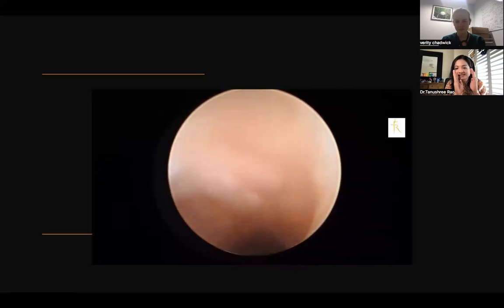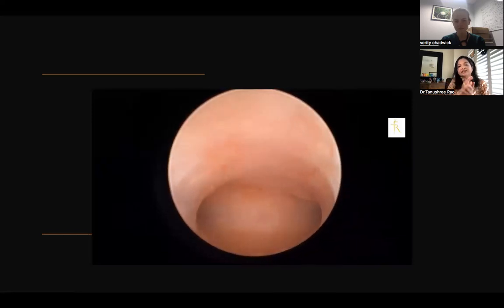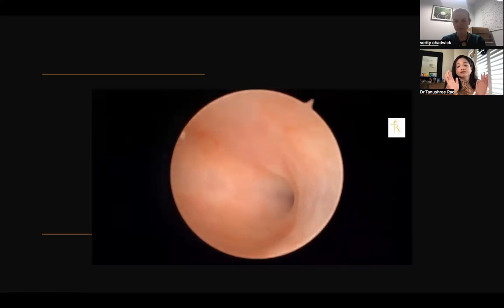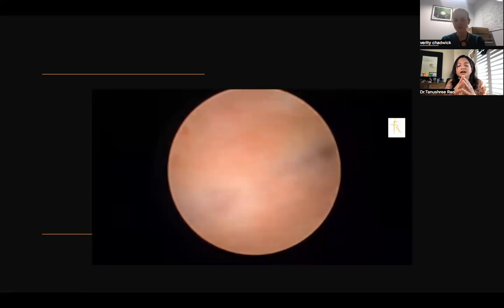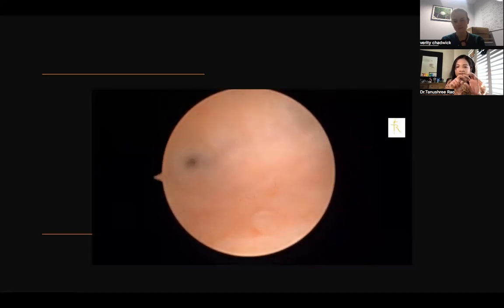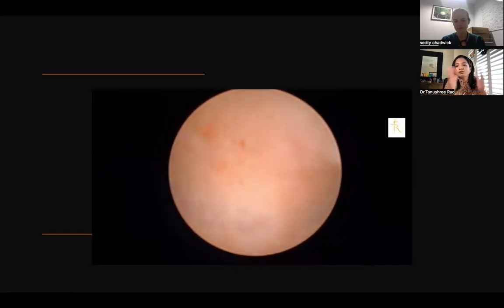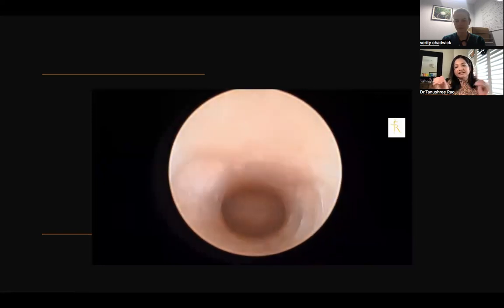Okay, so just stay over there. Use gentle corkscrew movements of your hysteroscope and then gently guide the hysteroscope in. And that's it. That's easy access. Most of the cervices you will be able to negotiate just with this trick alone. I usually go straight to the fundus, refocus, and then come back. And I've seen both the ostia, so that's just the opening of the tubes over there. And then you just pan back and have an overall look or a survey of the entire endometrium.